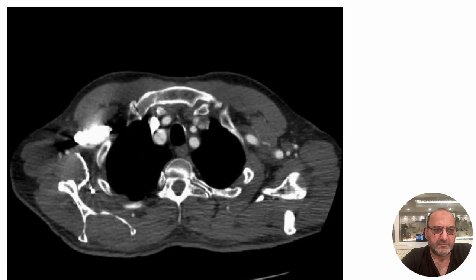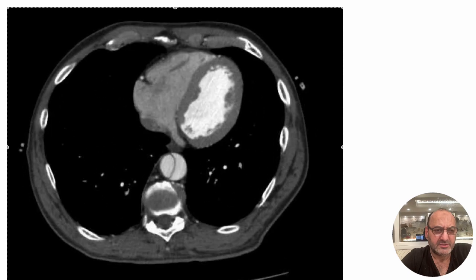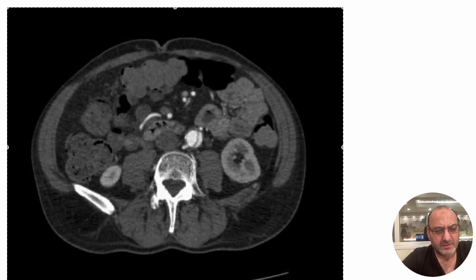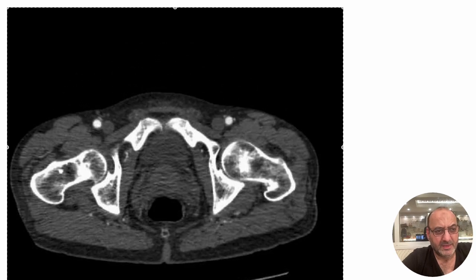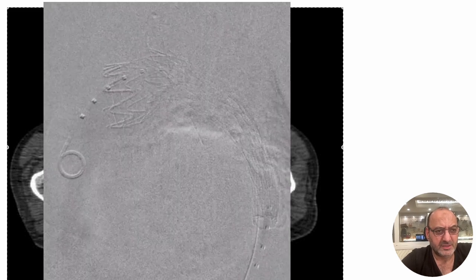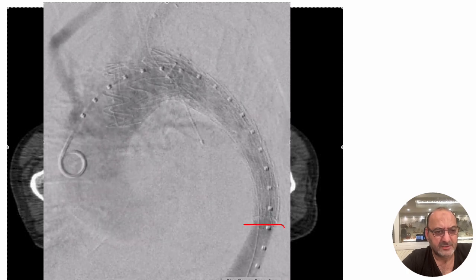This is a 41-year-old male who came in with acute type B dissection, chest and abdominal pain. His white count was 11. He did not have an acute abdomen, but he had tenderness in his abdomen. Lactate was around 4. Creatinine was about 2. So we did him semi-urgently. We placed a covered stent. It's right here, as you see.